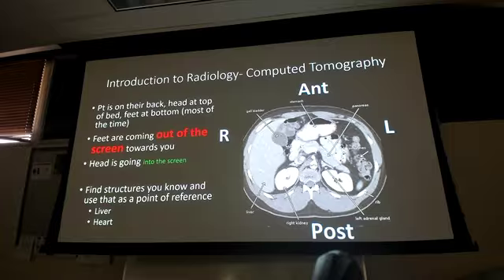So when I have a CT scan, the reason I'm good at that is, without a right or left marker, which I labeled here, you should be able to tell me which kidney that is just by looking at this slice. Right? Right kidney, because it's on the left side. On top of that, look, the liver and the gallbladder are over here.